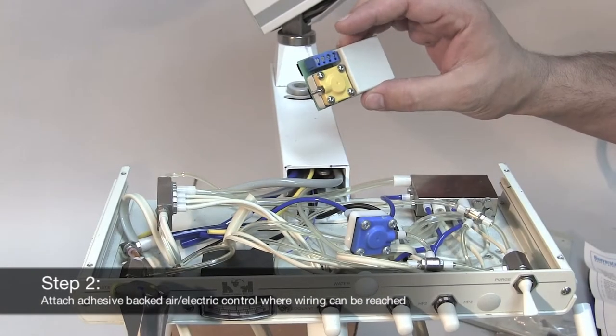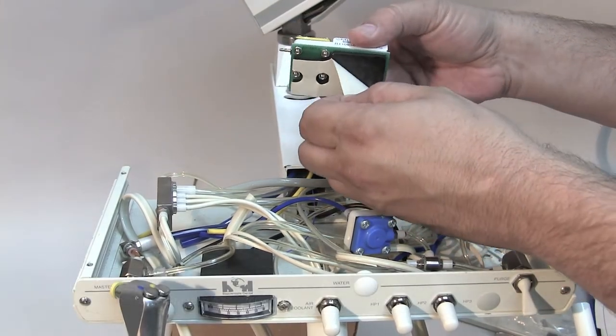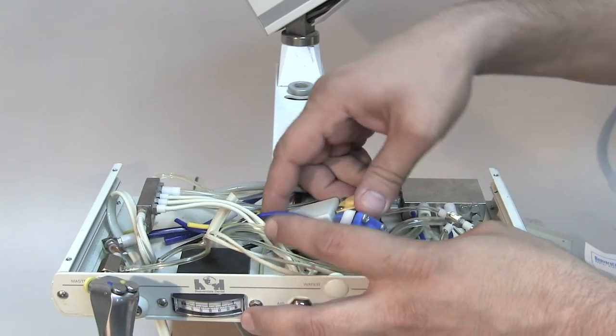Next, grab the air electric control and adhere it to the unit. Put it someplace where the terminals for the wiring and barb for the air signal tubing can easily be reached.